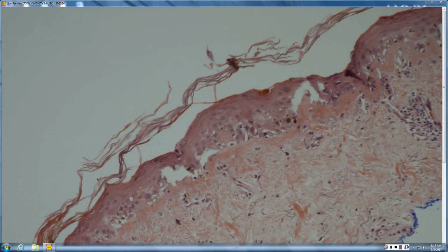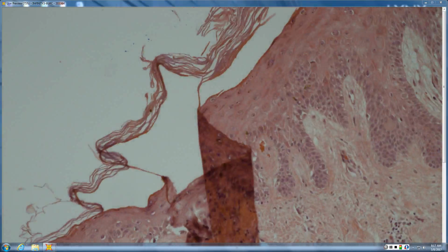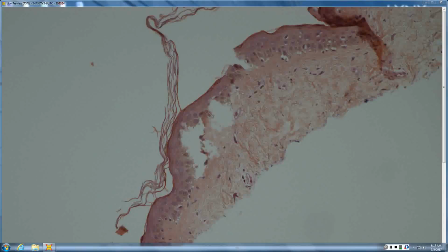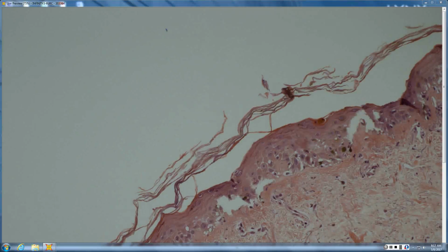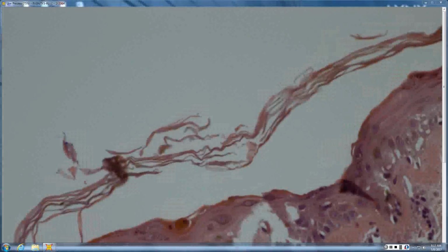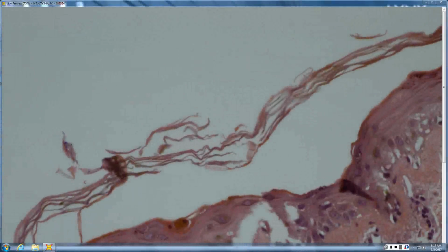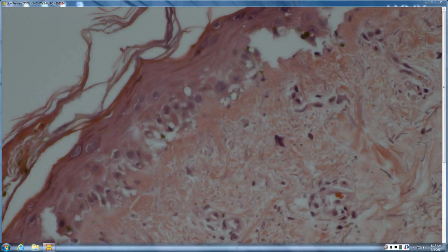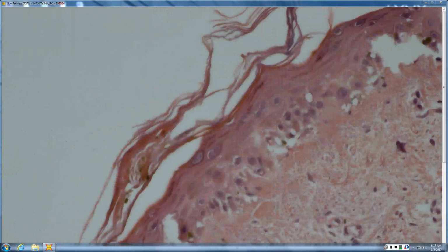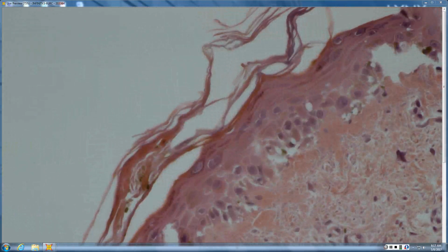A black patient? There's a lot of pigment there, but not necessarily a ton in the normal skin. Yeah, but I'm not sure that all of this looks like interface change. This would be interesting to take back to the lab and put a stain on.